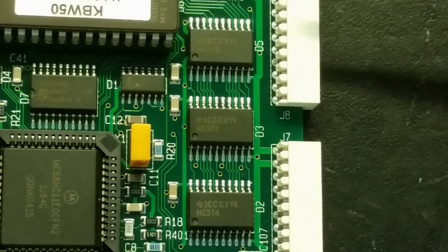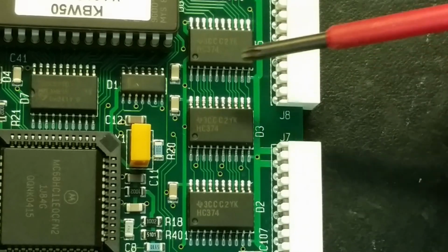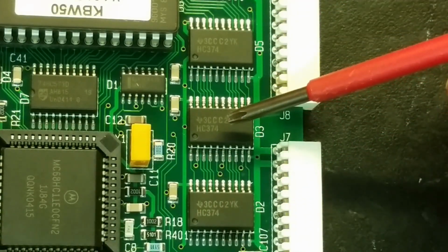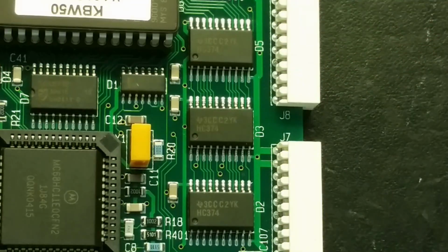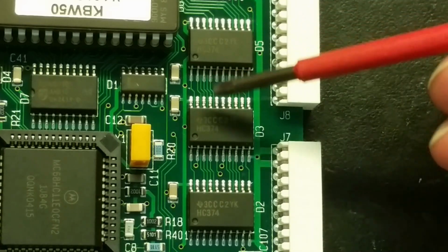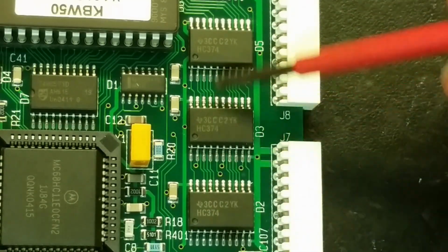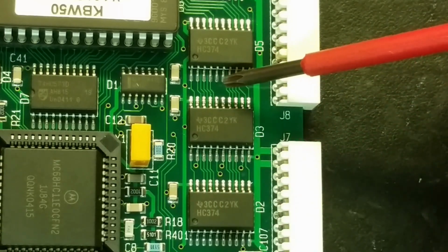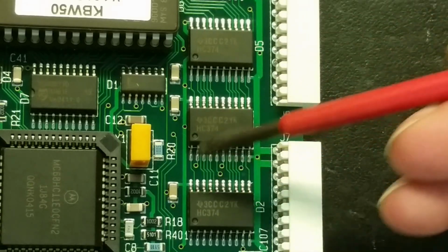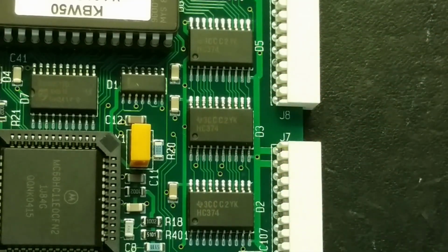And on the side here, there's a port that goes to the connector for a display, LEDs. And here we've got 3 of these HC374. And these are octal flip-flops, so there are 8 flip-flops in that, and they're working in a sort of counter when they're connected like this, I think. So it's maybe counting some steps of how the actual heating procedure goes.